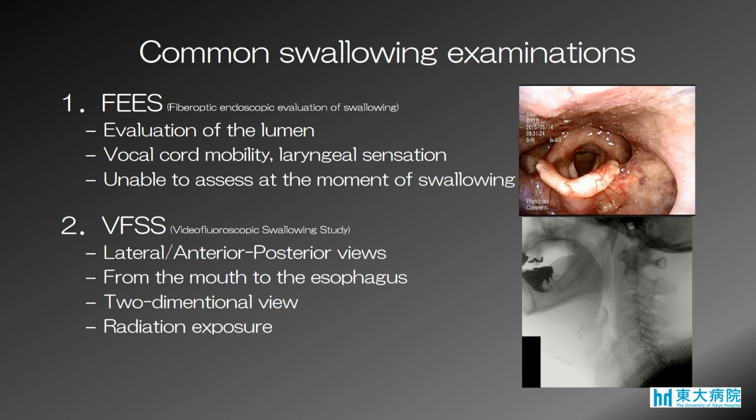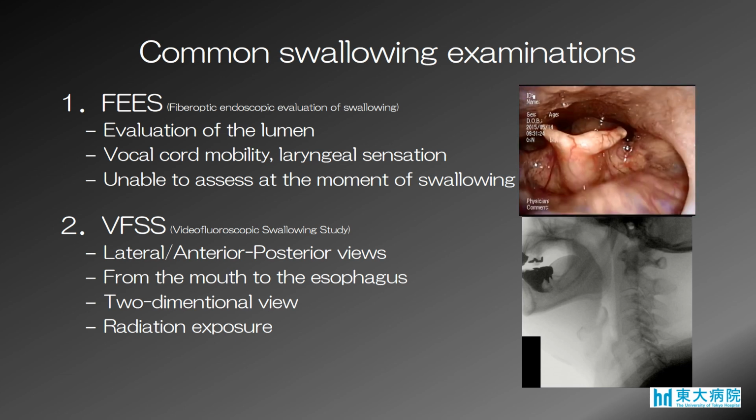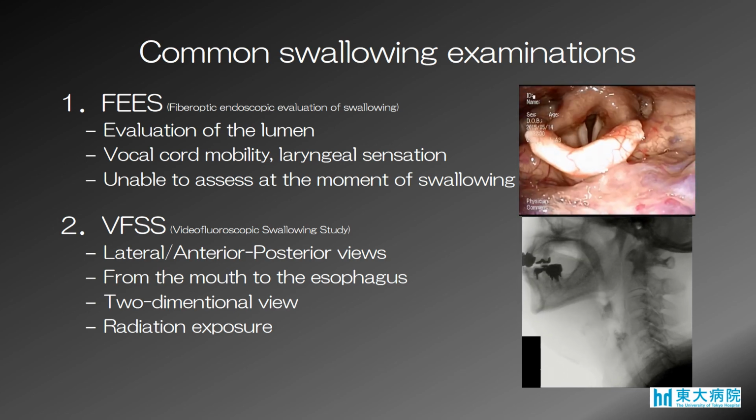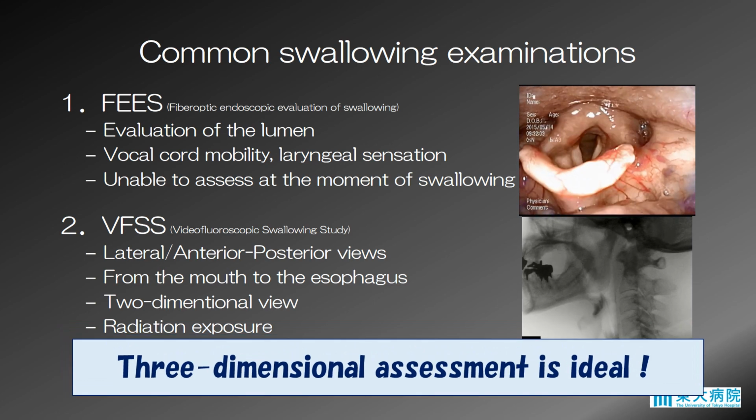As for VFSS, we can assess the swallowing function from the mouth to the esophagus in lateral and anteroposterior views. But this test has a problem of radiation exposure. We have been thinking that for a more detailed understanding of swallowing dynamics, three-dimensional assessment is ideal.